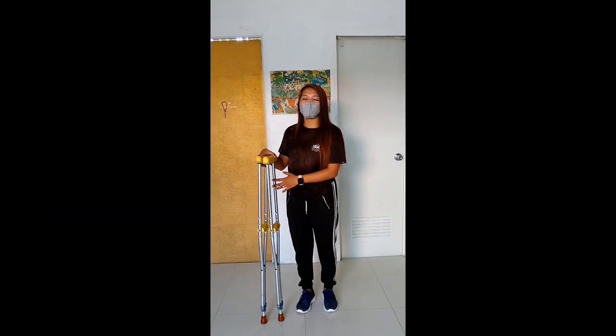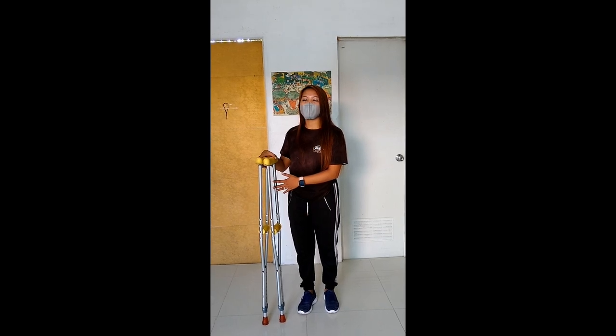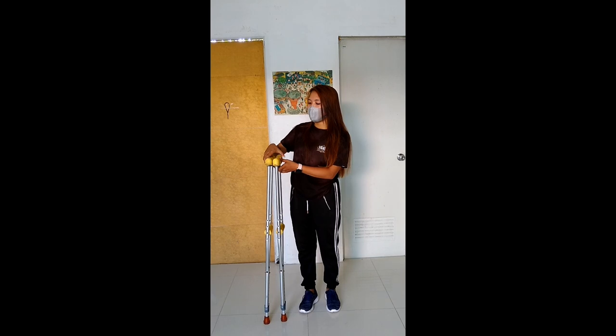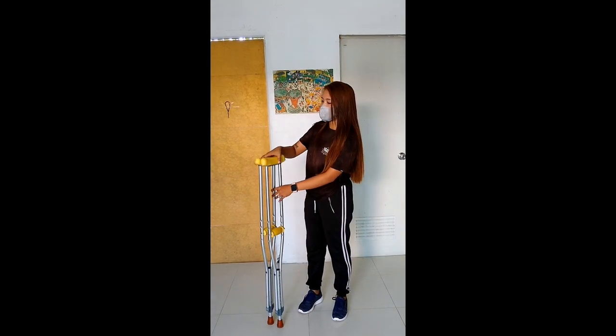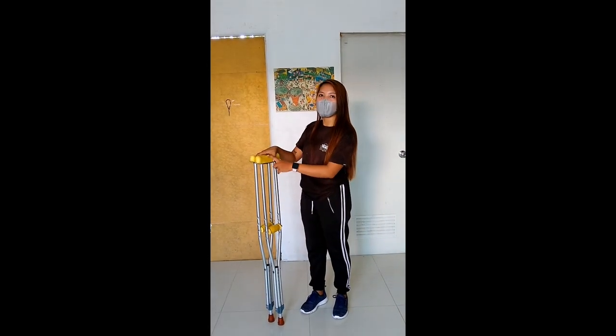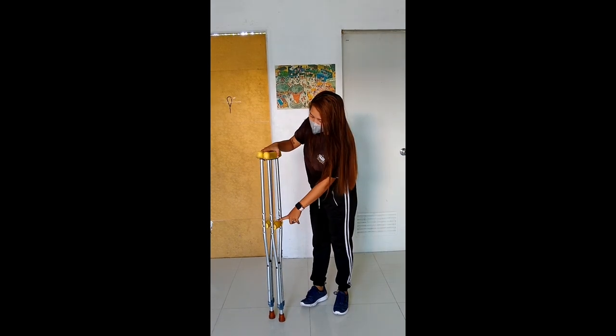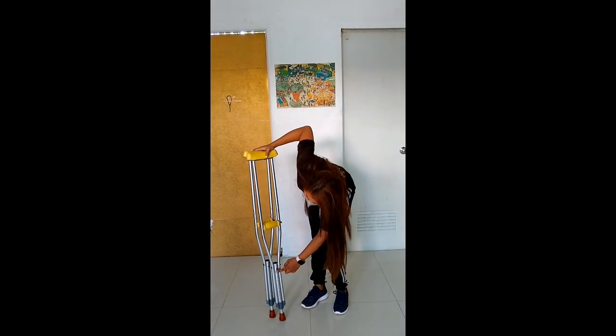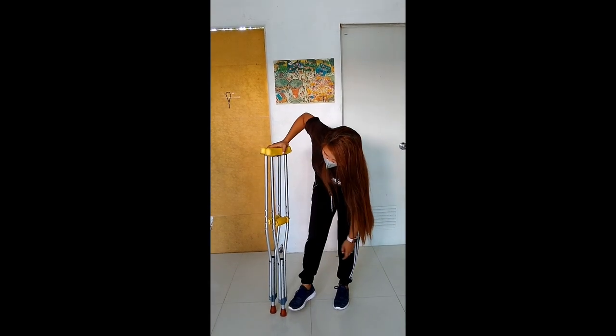Good morning everyone. For today I'll be demonstrating the different ways of using crutches. Ito po ang ating crutches, ito po ang crutch pad, hand grip, adjustment area, pati dito, at saka fair rule.